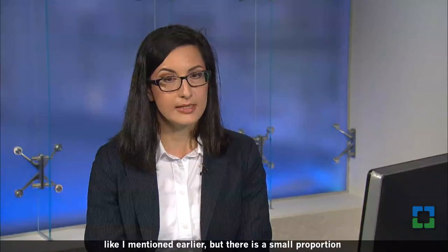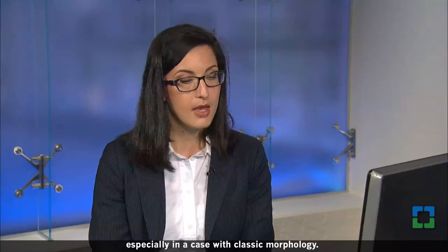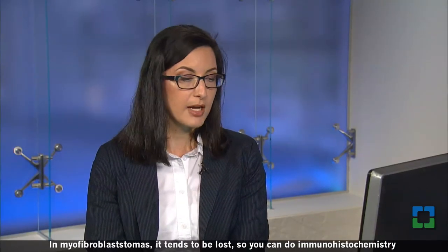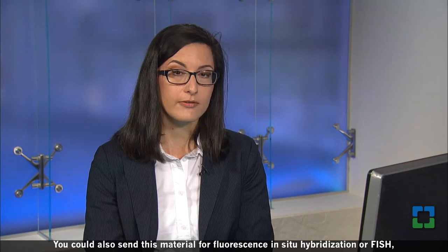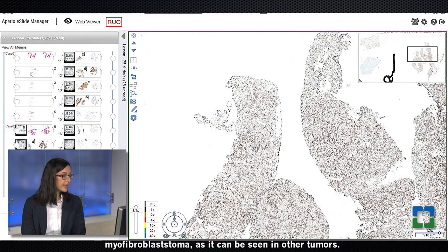The majority of myofibroblastomas will have desmin and CD34 expression, like I mentioned earlier, but there is a small proportion that will have negative CD34 and desmin expression. That should not preclude you from making the diagnosis of myofibroblastoma, especially in a case with classic morphology. However, if you would like to, you could investigate further and do additional studies. You could evaluate the presence of retinoblastoma tumor suppressor gene, or RB. In myofibroblastomas, it tends to be lost, so you can do immunohistochemistry for RB1 and look for that absence. You could also send this material for fluorescence in situ hybridization, or FISH, which will show the loss of 13q14, or the retinoblastoma locus, in about 80% of these cases. However, be mindful that the loss of RB is not entirely diagnostic for myofibroblastoma, as it can be seen in other tumors.